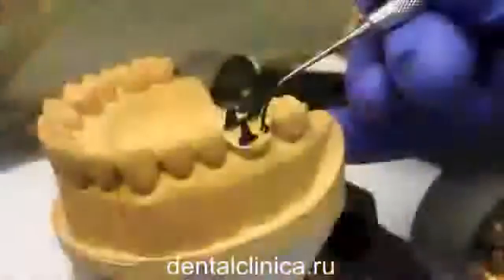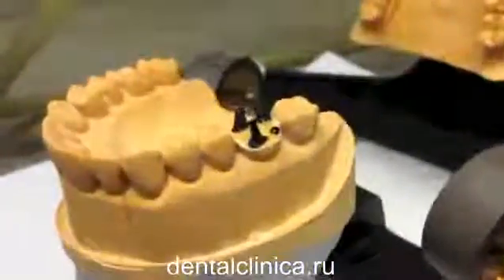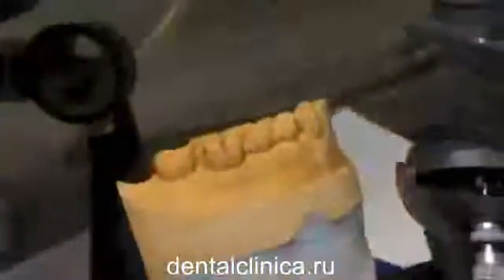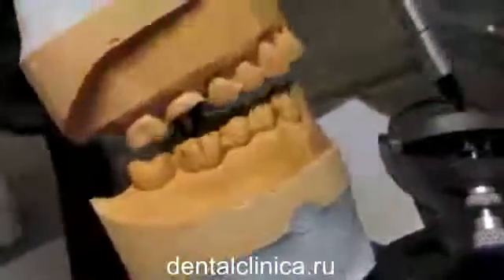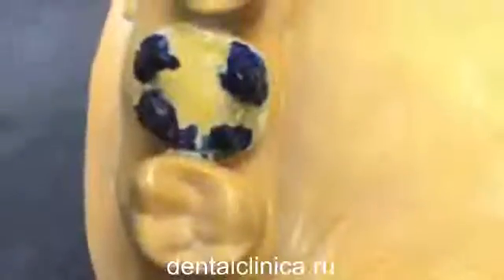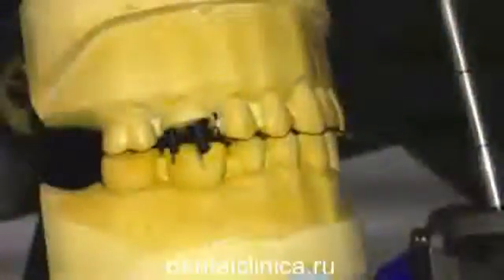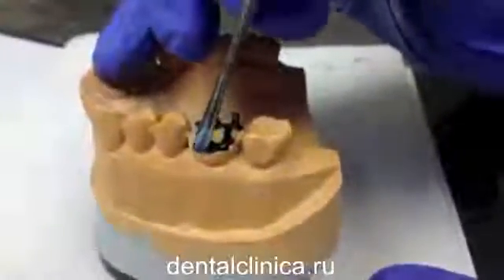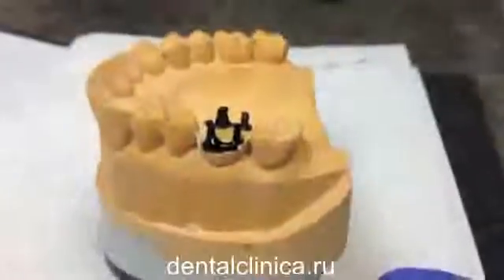Next, we will move on to the distal buccal cusp of tooth number 3. The same markings will be used as reference again. Next, we will create a fish mouth around the peripheral border of tooth number 3.